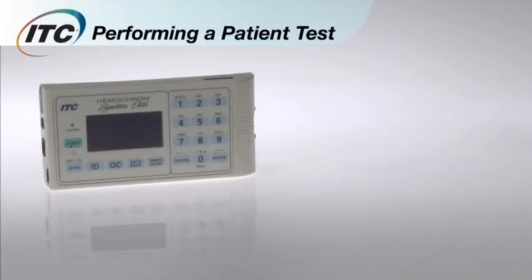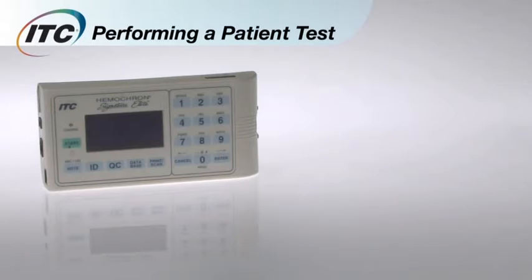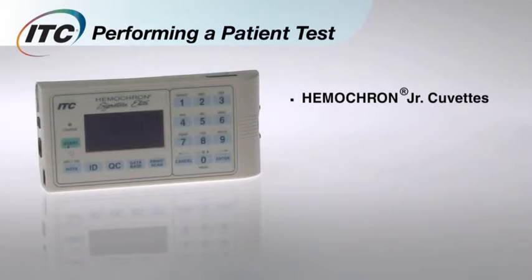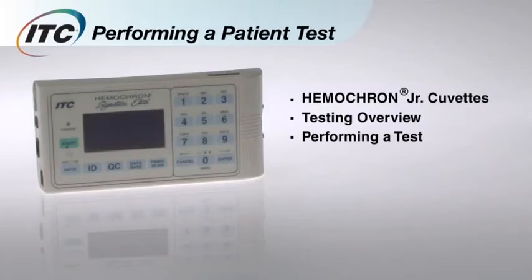Now you'll learn how to perform a patient test using the ITC Hemocron Signature Elite. You'll see how Elite reduces errors due to operator technique and gives you fast, accurate results right at the patient's side. First, we'll look at the features of the Hemocron Junior cuvettes. Then, you'll get an overview of Elite's test process. Finally, you'll learn how to perform a test.